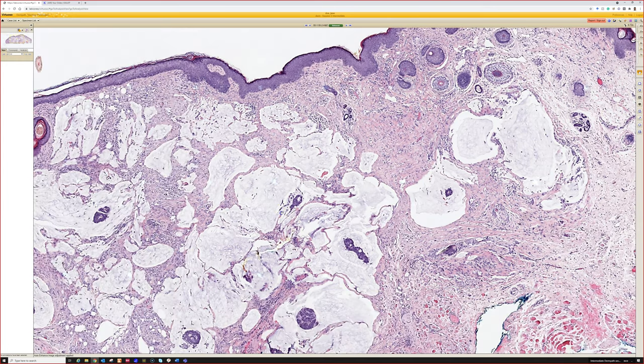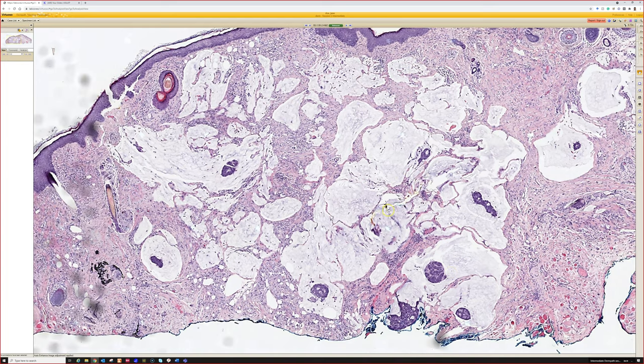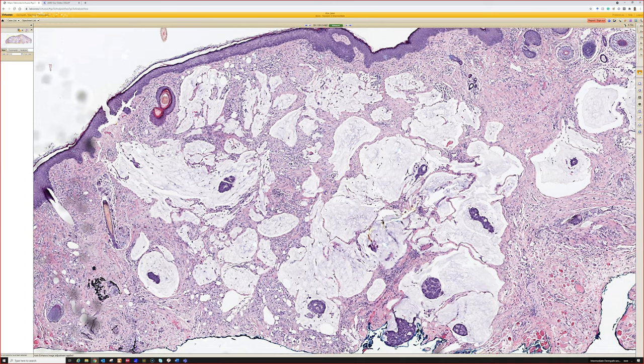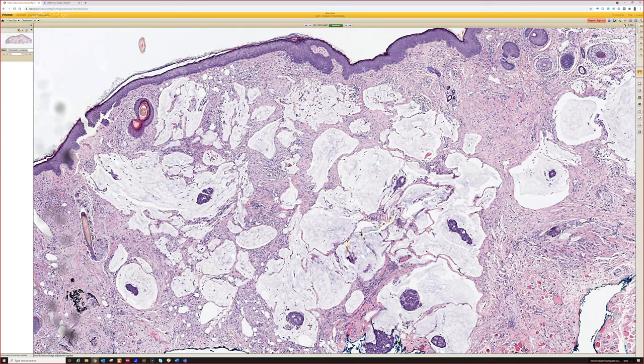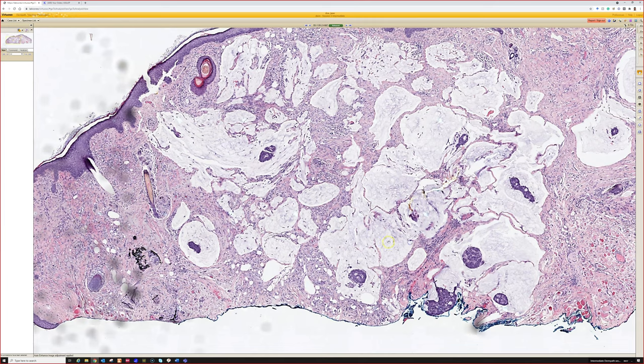One thing that can be really helpful is if you find an in situ component. You'll see an area that looks kind of like a hydrocystoma and has solid areas growing in it and then transitioning to mucinous carcinoma. That is basically definitively a primary tumor if you find that. We don't have that in this case. And that kind of precursor form is also known as endocrine mucin-producing sweat gland carcinoma, which is kind of a complicated topic, but it's thought to be an in situ precursor lesion that turns into mucinous carcinoma in some cases. That's a very simplified version of that story.